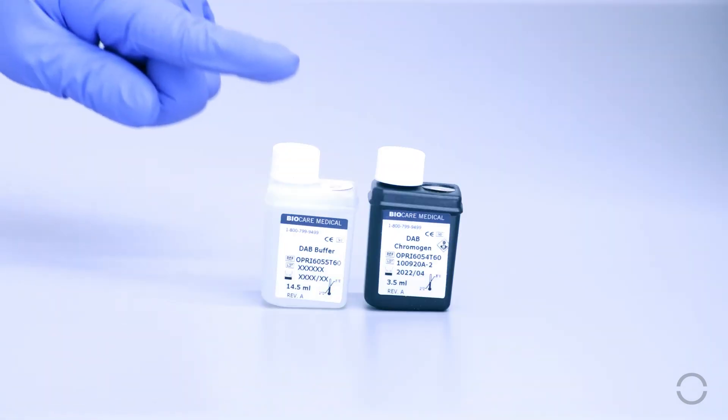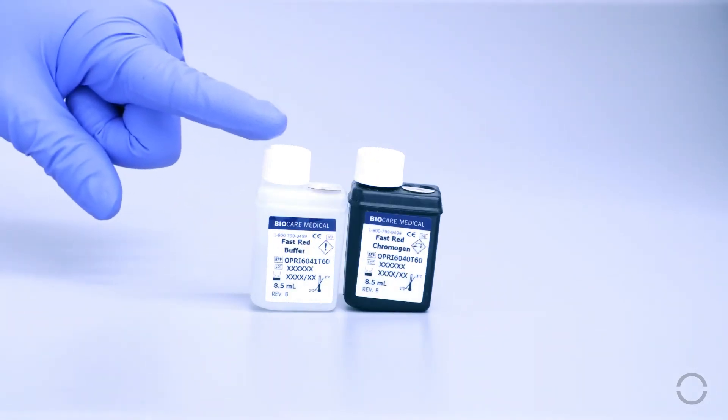The ONCORE Pro DAB chromogen kit consists of two solutions. The Fast Red chromogen kit also consists of two solutions.